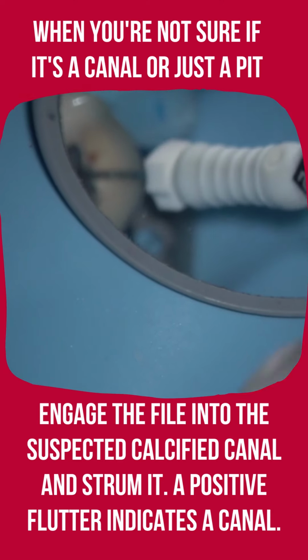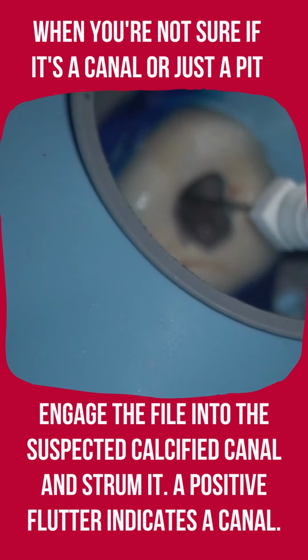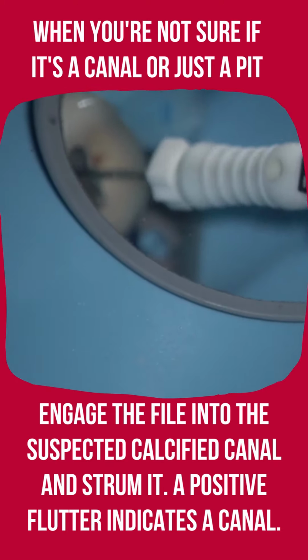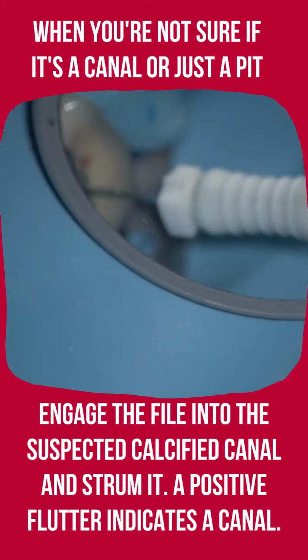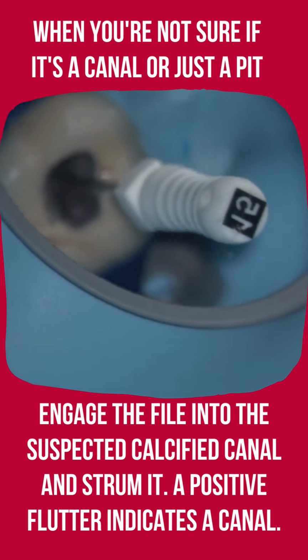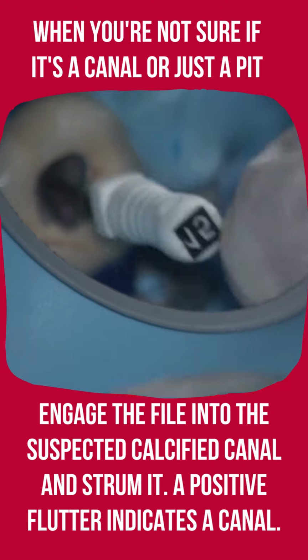Now when I have this calcification and I think I have an access there, I'm going to take my instrument and place it very gently into the canal opening. And if it engages really tightly and I need to check if I'm in the canal, then look what I do. I strum it like a guitar string and I'm getting what you call a flutter.